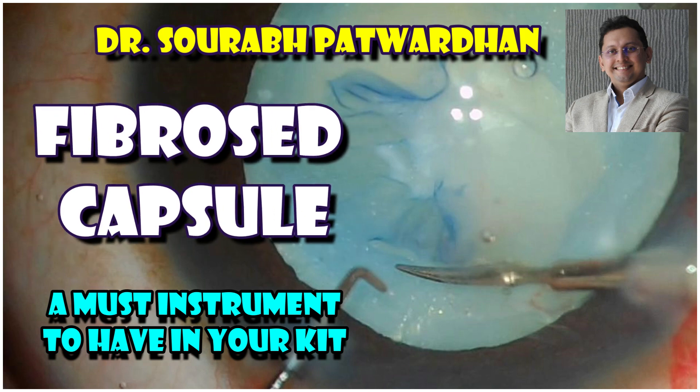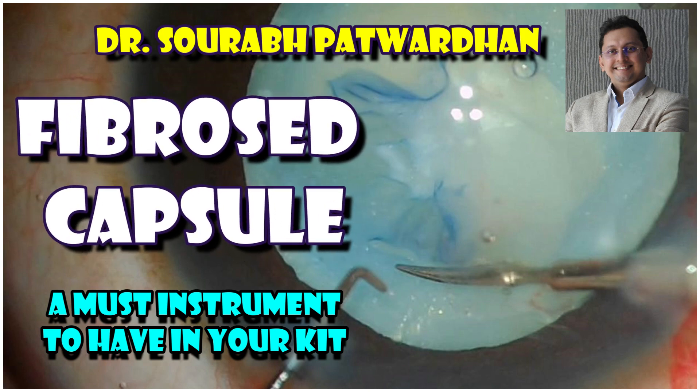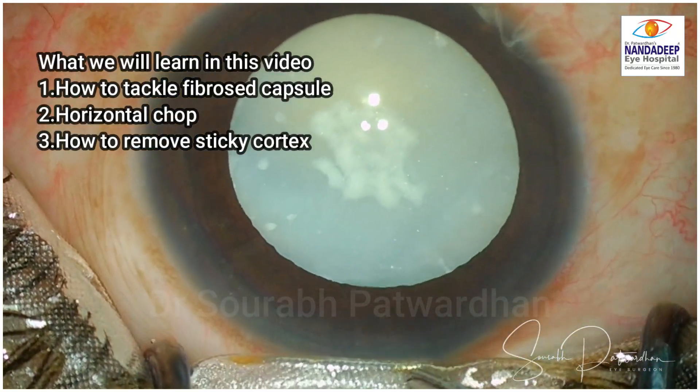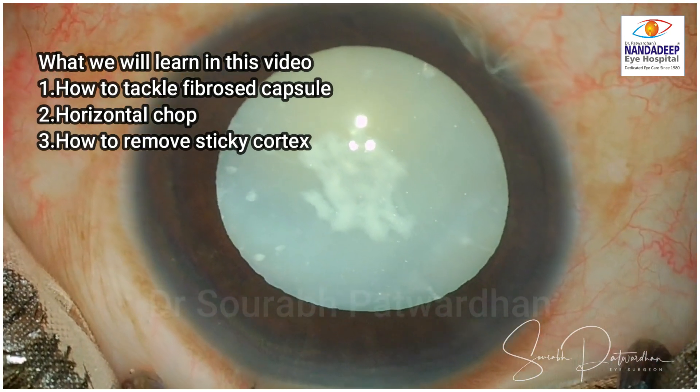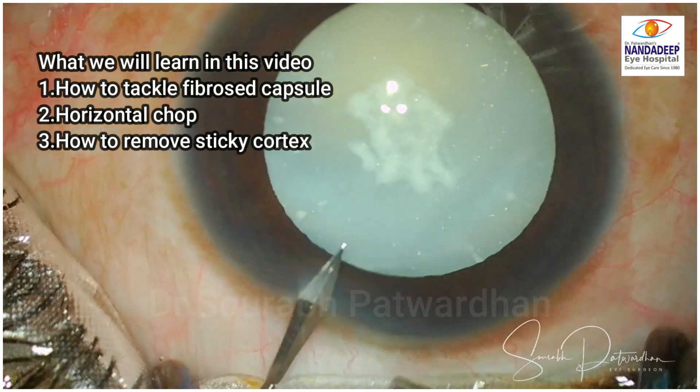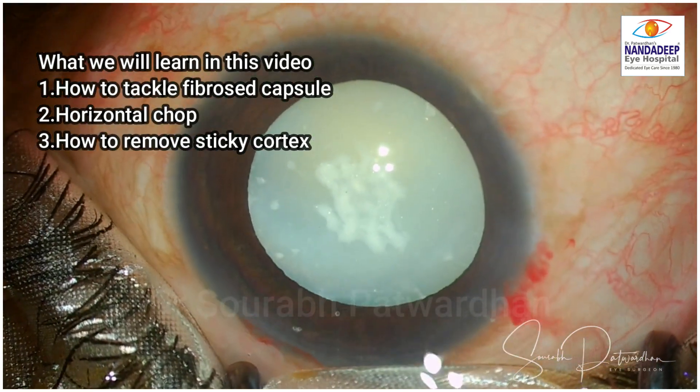In this video, I will be showing a case with fibrocapsule and what is the most important instrument to have in your kit for tackling such situations. So what we will learn in this video is how to tackle the fibrocapsule, how to do horizontal chop and also how to remove the sticky cortex which is very common in these kind of cases.